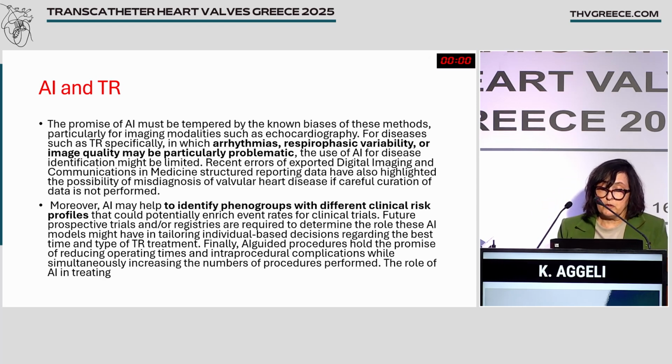particularly for imaging modalities such as echocardiography, for diseases such as TR, specifically in which arrhythmias, respiratory phasic variability or image quality must be particularly problematic.